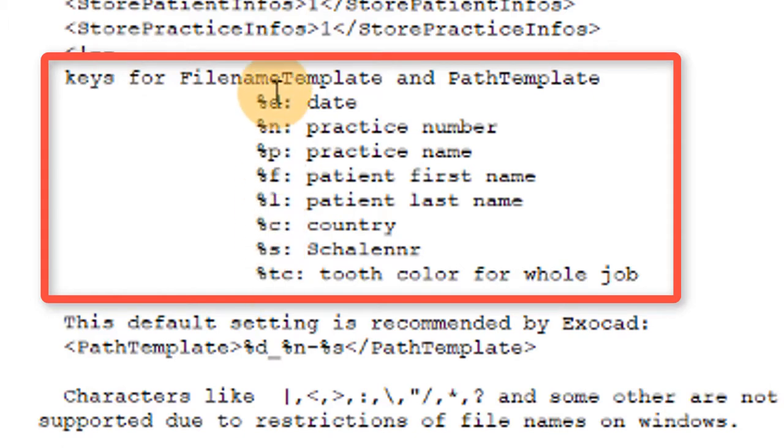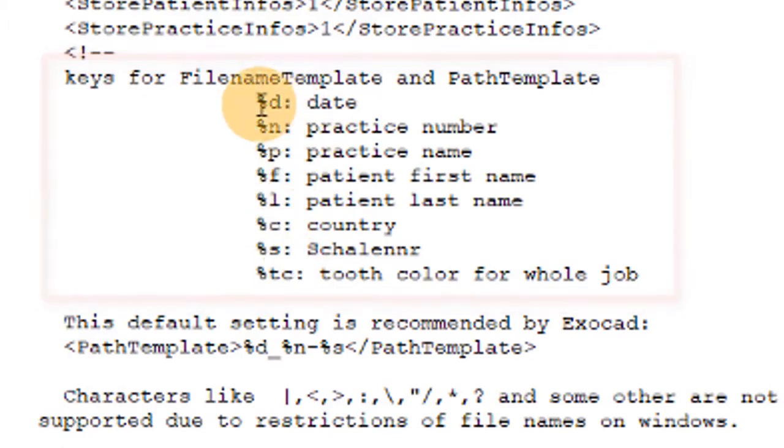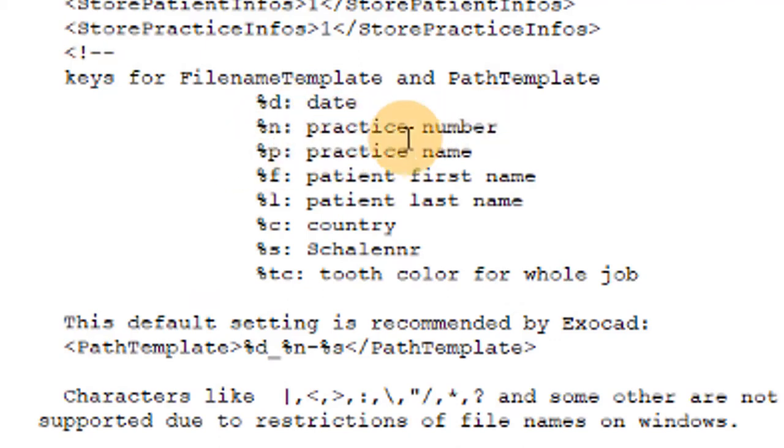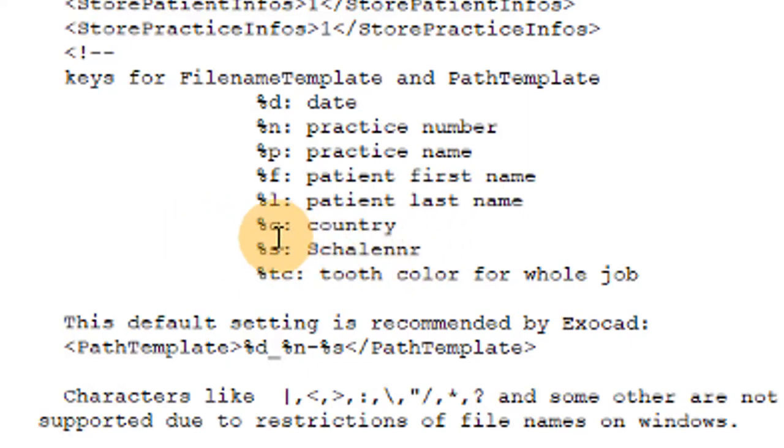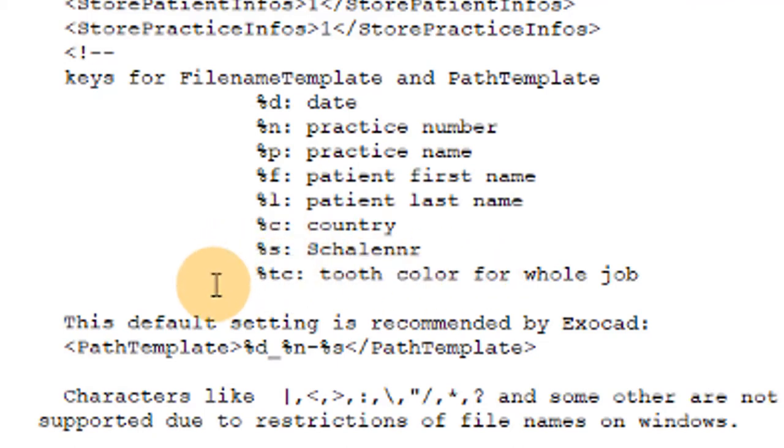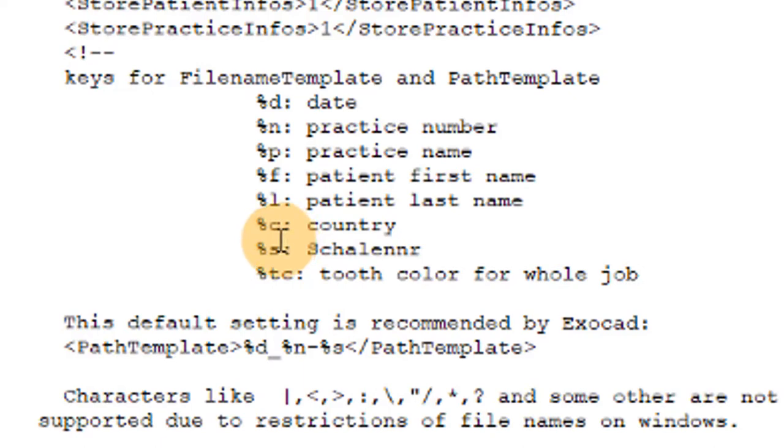And it says keys for file name template and path template and it shows you what the codes mean. So percent D means date, percent N means practice number, percent P practice name, percent F, percent L are the patient's first and last name, C for country, S I don't know what that word is in German, and then TC for tooth shade. S may be the identification number ID number. In any case, I don't use that.